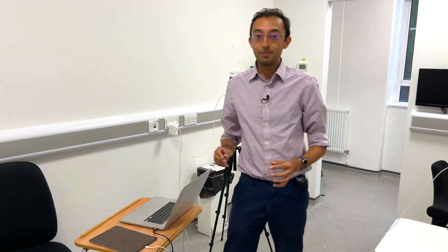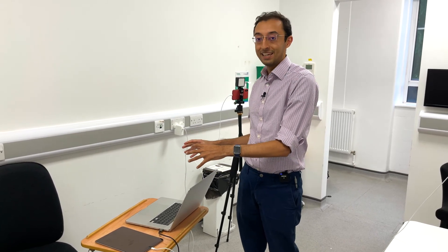Beyond the technical setup, there was a lot more work that went on behind the scenes. Rebecca was running around making sure the patients were booked in. We had lots of help from our secretaries, receptionists and nurses, while I was sitting here acting as almost like a producer — switching the video feeds and changing the contrast and exposure for different types of slit lamp examination. Rebecca went and got the patients, took them to the room next door, consented them, and made sure the timings were as efficient as possible.